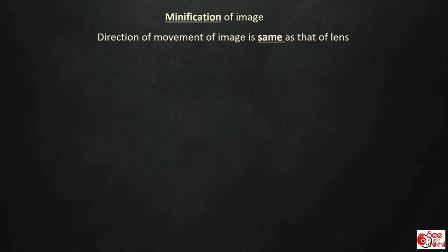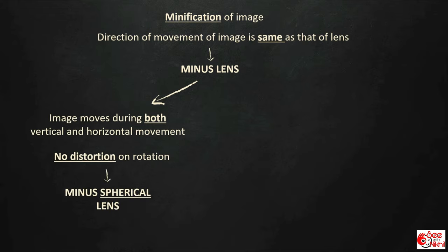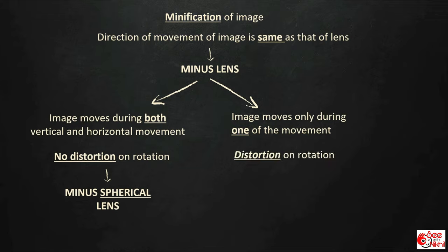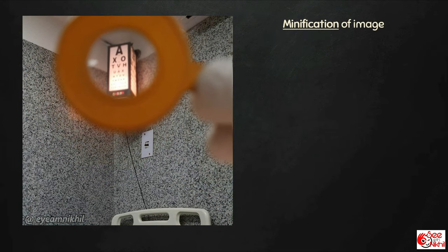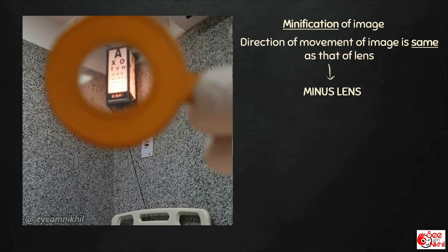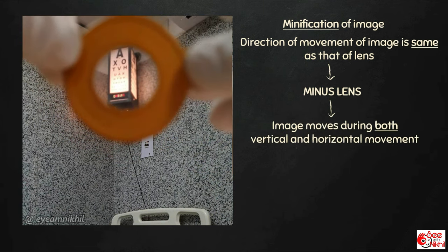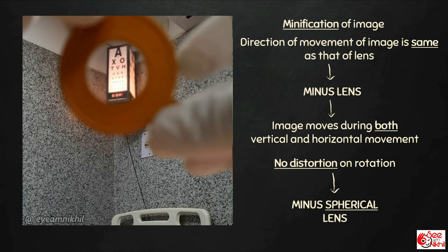If there is minification of image and the direction of movement of the image is the same as that of the lens, that means it is a minus lens. If the image moves during both vertical and horizontal movements and there is no distortion on rotation, that means it is a minus spherical lens. But if the image moves only during one of the movements and there is distortion on rotation, that means it is a minus cylindrical lens. In this video, there is slight minification, movement is in the same direction as the lens — it is a minus lens — and the image moves during both vertical and horizontal movements with no distortion on rotation, confirming it is a minus spherical lens.